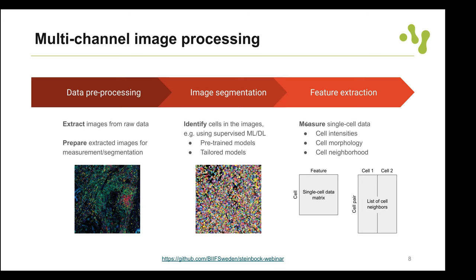Finally, to enable graph-based and network analysis on these images, it's useful to export neighborhood information as attributed spatial cell graphs — spatial cell graphs that include intensity information as attributes. Various file formats support this in existing software; one of them is GraphML. Here I'm showing how to export all neighborhood information including intensities and regionprops as attributed graphs.